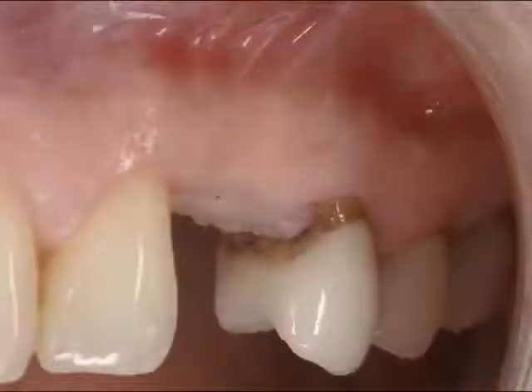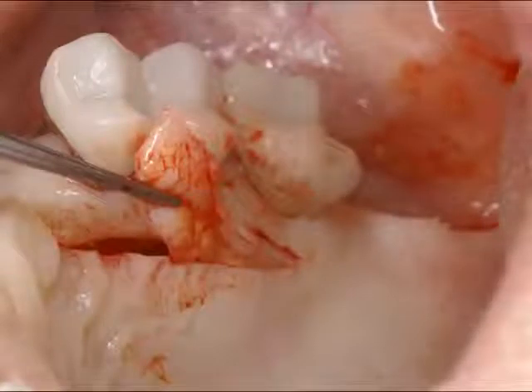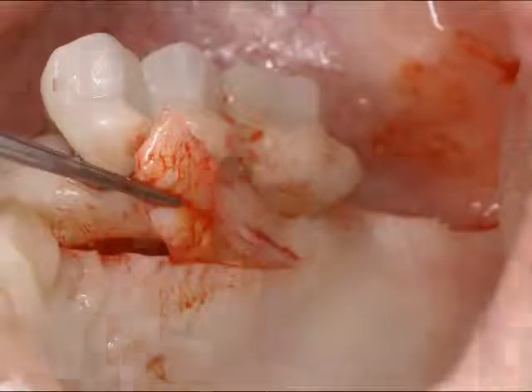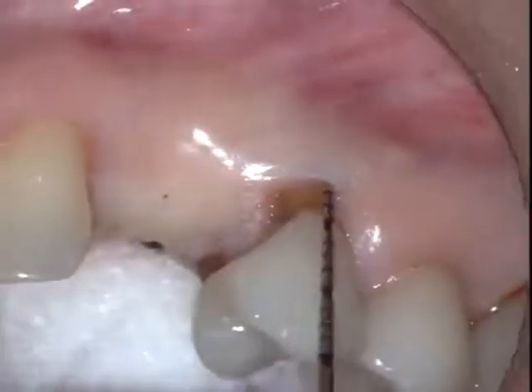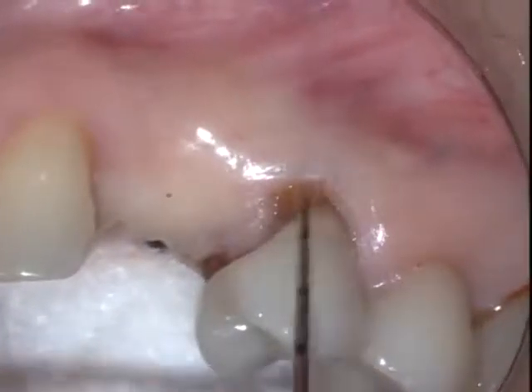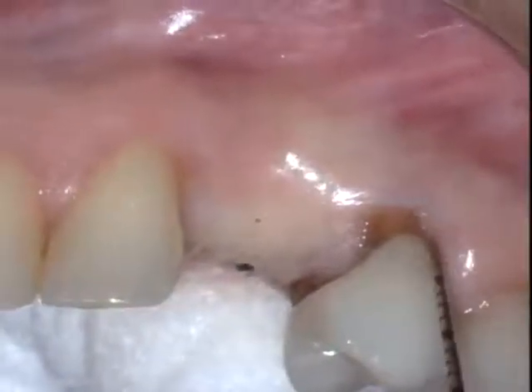This patient suffered a loss of the maxillary left canine, and a bone graft in this area provided us with enough augmentation to place a dental implant to replace this tooth. Because of the deficiency in keratinized tissue and ridge thickness, a connective tissue graft was harvested from the patient's maxillary left palatal region. Once this tissue was taken, we went ahead and bone sounded the area clinically to ascertain the location of the underlying bony crest.